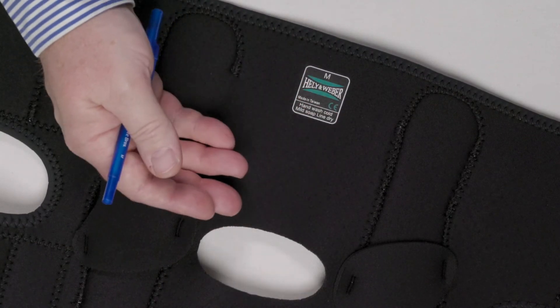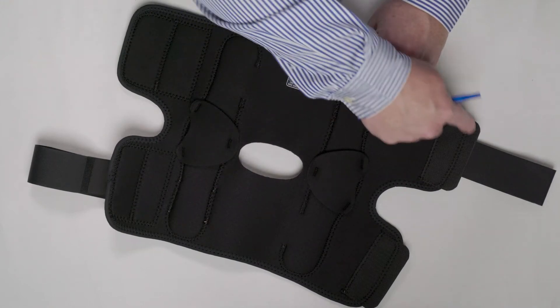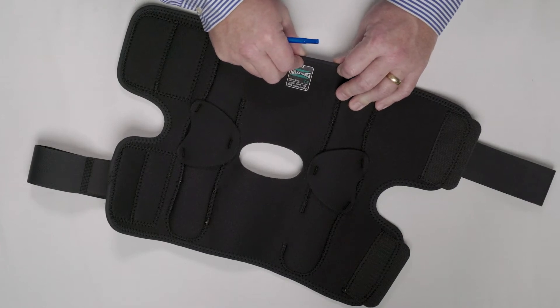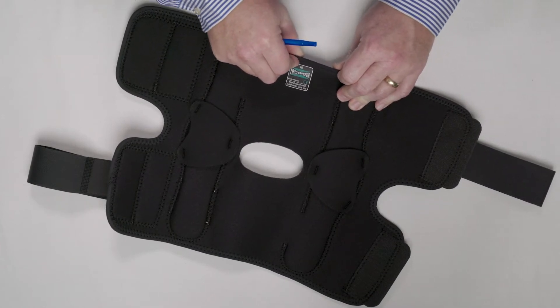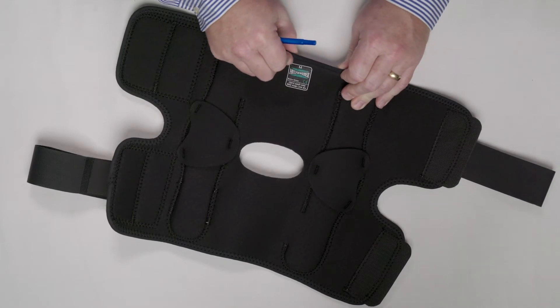Finishing that cool neoprene is a binding. The entire brace is bound to prevent that neoprene from tearing. Our binding has the same stretch coefficient as the neoprene, so we don't cause constriction or discomfort to the patient.